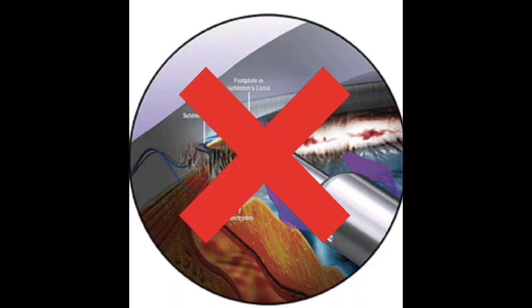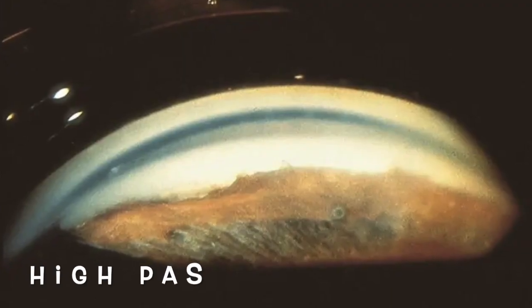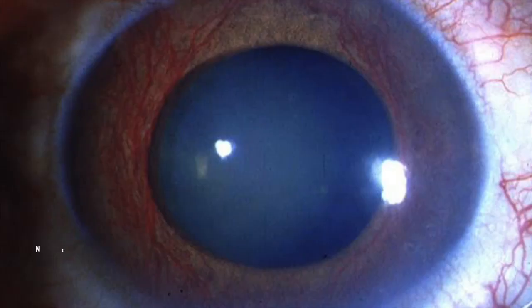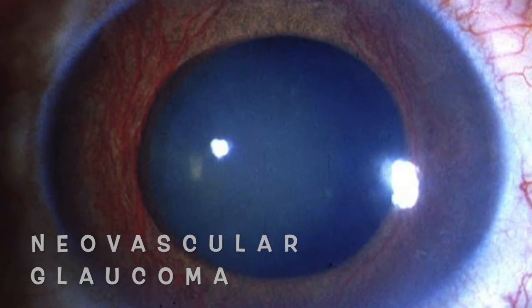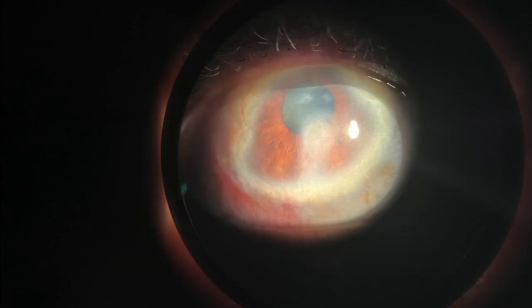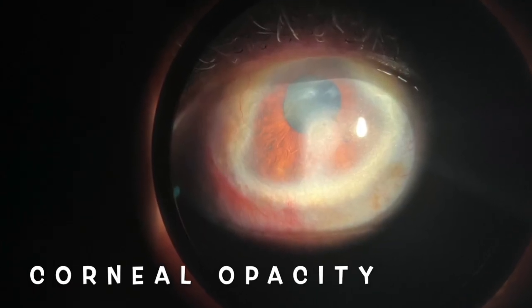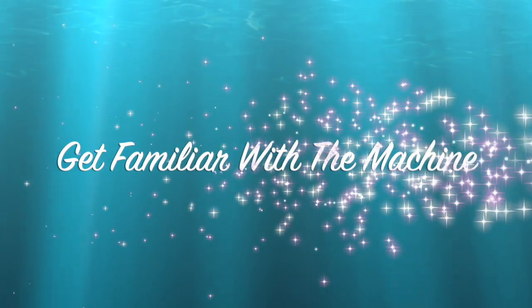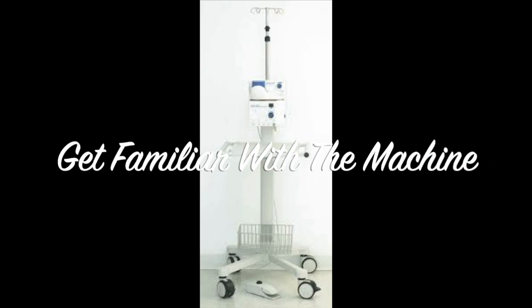So, what are the cases that you want to avoid as a novice trabectome surgeon? If on gonioscopy you see significant high peripheral anterior synechiae, especially in the nasal angle, this is likely not a good candidate. Try and avoid neovascular glaucoma cases, patients with corneal opacities obstructing your view, and patients on anticoagulants as your first few patients. It's imperative to familiarize yourself with the machine at the outset.